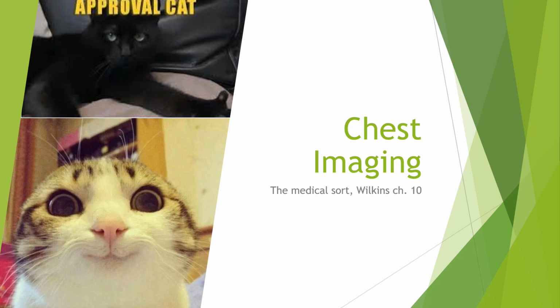the diagnostics of things other than chest x-rays, which CT scans are becoming more and more common in the pulmonary and critical care world, not only for diagnostic, but also for therapeutic images. And you even see them with studies out there. So this is not a bad area to have a little bit of focus. So let's get started. Now, most of this is from Wilkins chapter 10. So if you're wondering, that's where it's coming from.